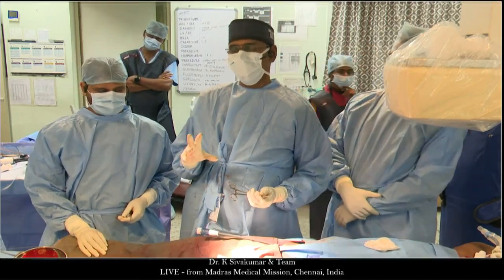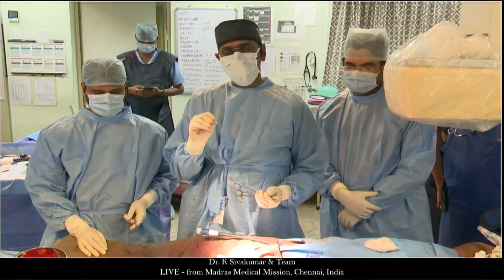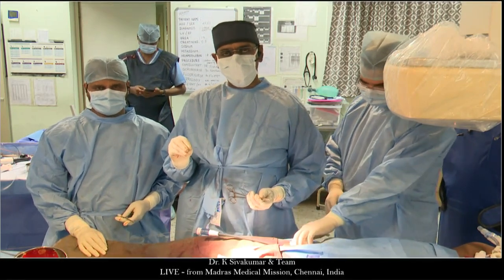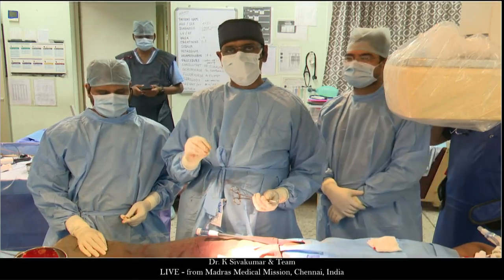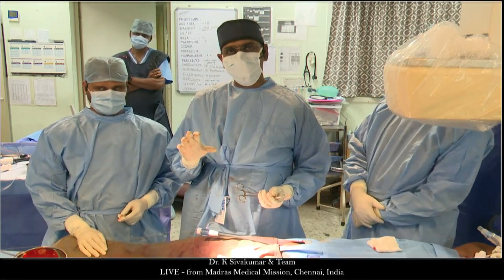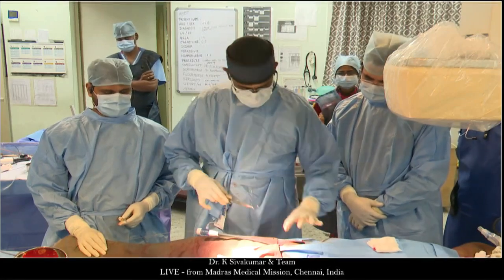The reason being, these are veins that are very small, measuring 8 millimeter or 9 millimeter. If I go and put in a balloon and create some minor endothelial injury, they will be the harbingers of further pulmonary vein stenosis. So we try to avoid unnecessarily causing an endothelial injury on the pulmonary vein. Great.